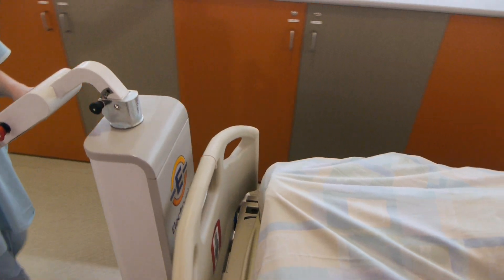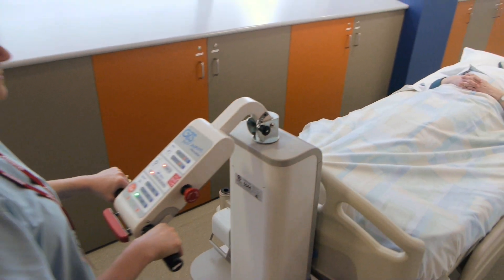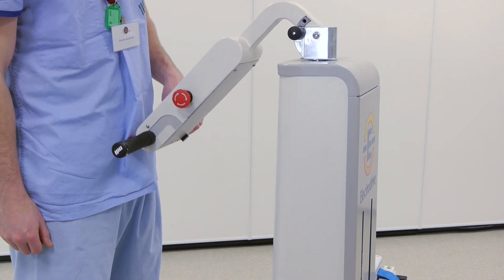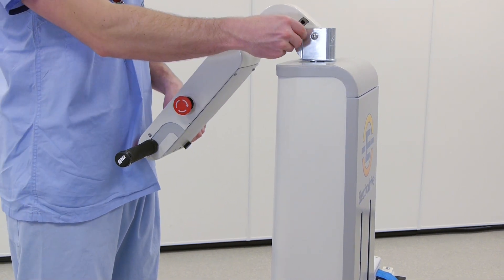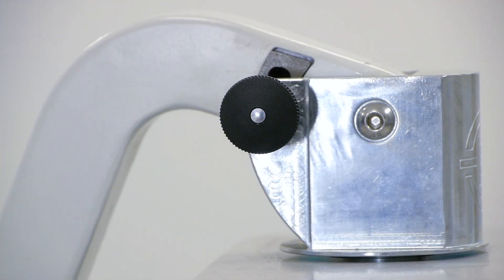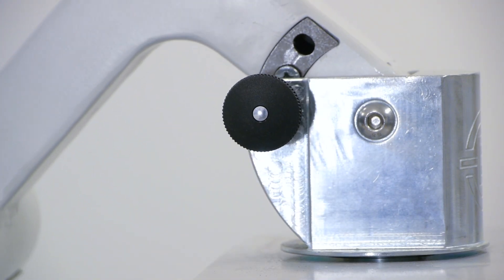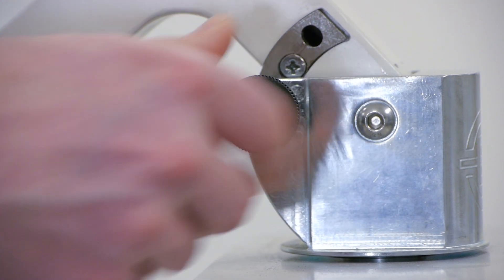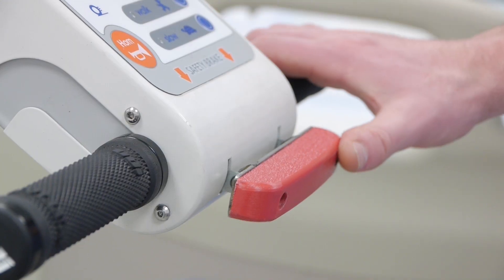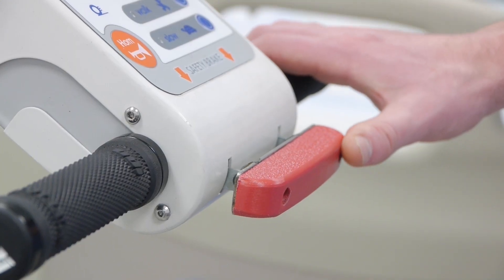Here are a couple of tips to help you get the most out of your Gezunda. The height of the handles can be adjusted quickly and easily to suit different operators or minimise the length in lifts. For example, just pull the pin outwards, adjust the height and release the pin.